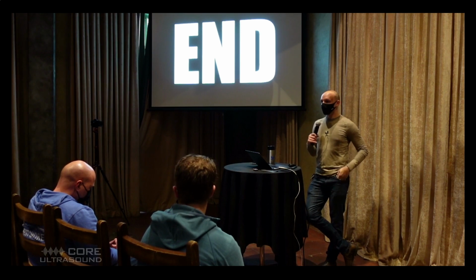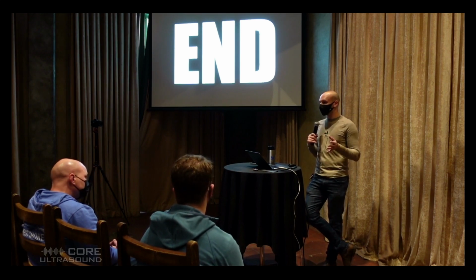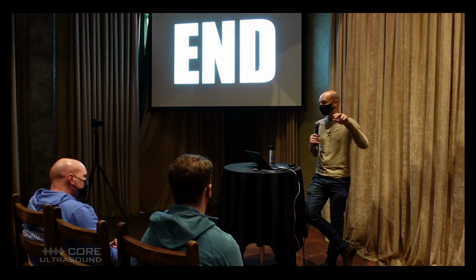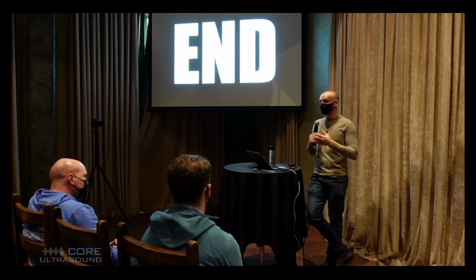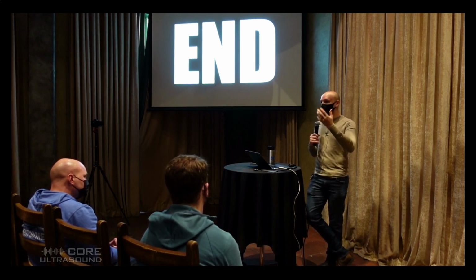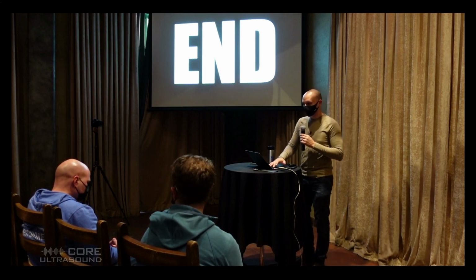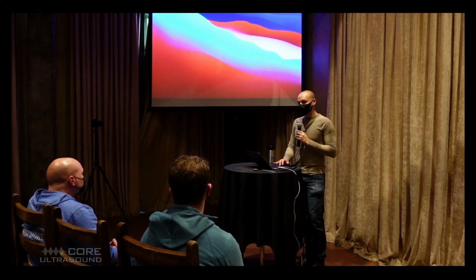That's great. And if anybody wants to do TAPSE or S prime, they're pretty easy calculations to do. They're pretty similar. You just use M mode for one of them and use pulse wave Doppler for the other. But we can work on all of that on the hands-on as well if you have any of those questions. Yes, sir? Does TAPSE differentiate between acute and chronic? I think there's some data that says maybe, but I don't think it does.